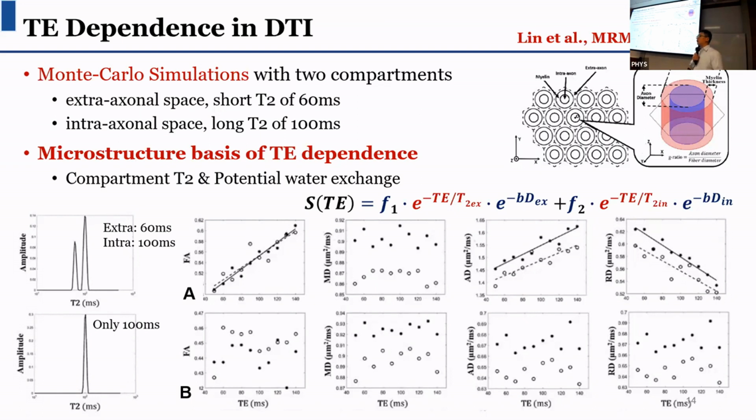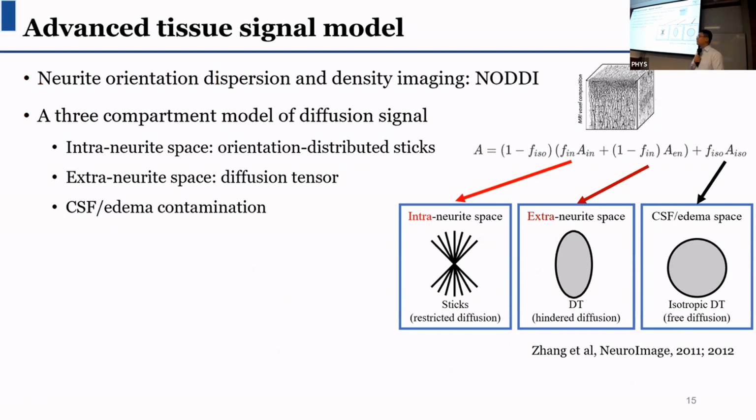And actually, in this simulation we also discussed the potential water exchange, as the reviewer suggested. But I would just say this water exchange is quite controversial in diffusion. At the end, I decided not to talk more about it.